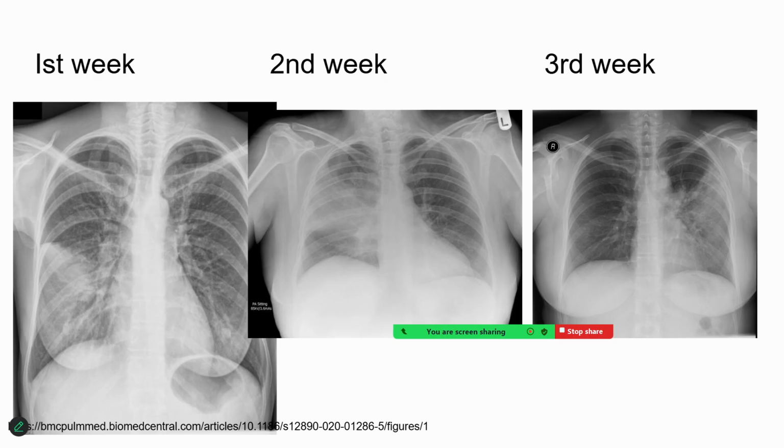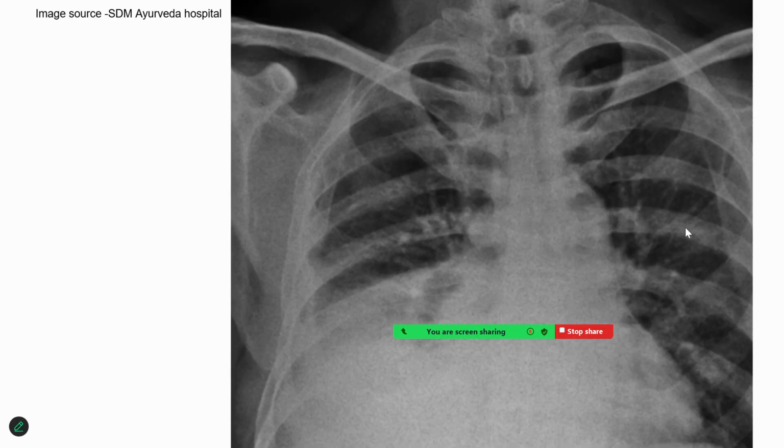Clinical symptoms tend to get relieved, or maybe in a complicated condition it may reach the other lobes also. But the standard course of pneumonia is a 3-week course, and during that phase there would be liquefaction of these solid substances, and the patient would expectorate that out. That is seen in the X-ray as air entering into the alveoli, and you will see these air shadows in the consolidated area, which is classical of pneumonia as such.